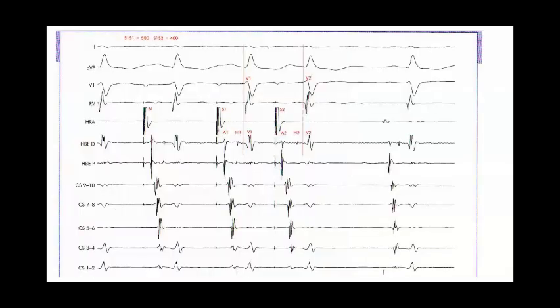So here the most beneficial is atrial extra stimulus testing. I have a train. I call this train S1 with S2 at its end. Like here it's 500, 400. 500 is the distance between S1 and the S1. 400 is the distance between S1 and S2. This is 400 milliseconds. Then I measure the distance between the A and the H.